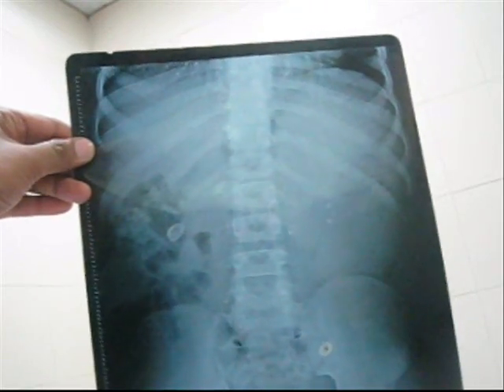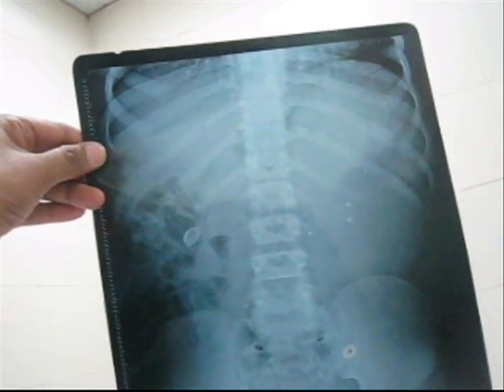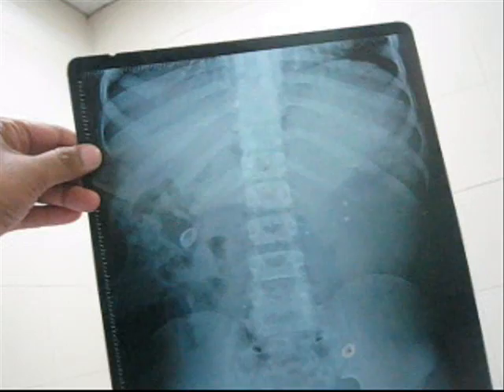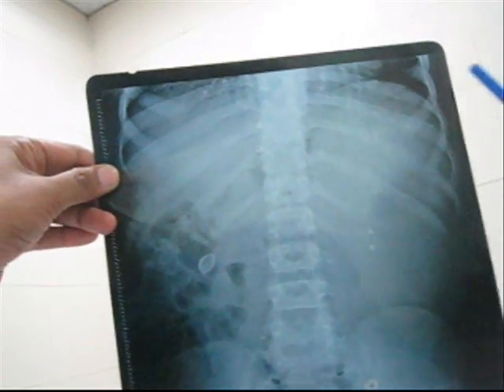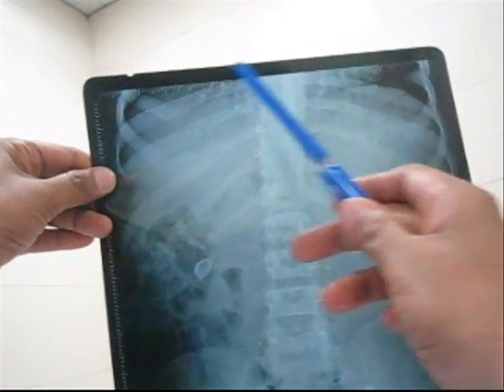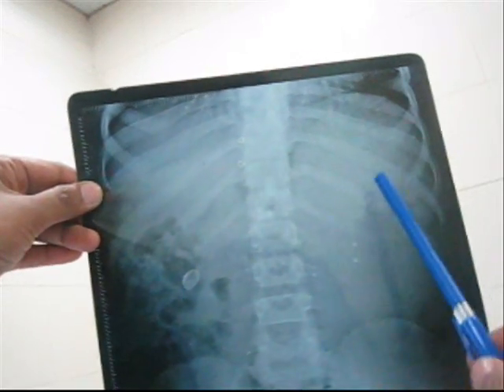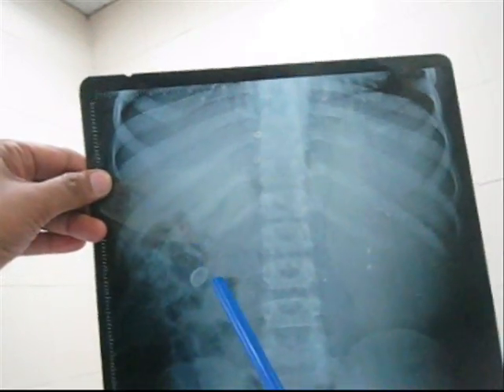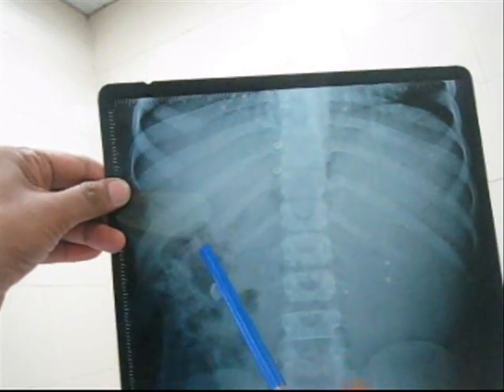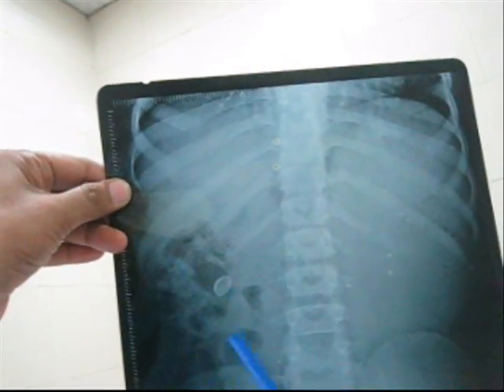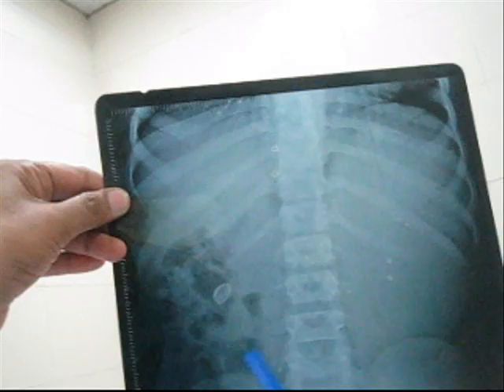This is the plain x-ray KUB — the kidney, ureter and bladder region — showing you a little bit of the chest area so that you can see the gas under the diaphragm. Here you see a radio-opaque shadow, and here you see some radio-lucent shadow — maybe some feces in the bowel.